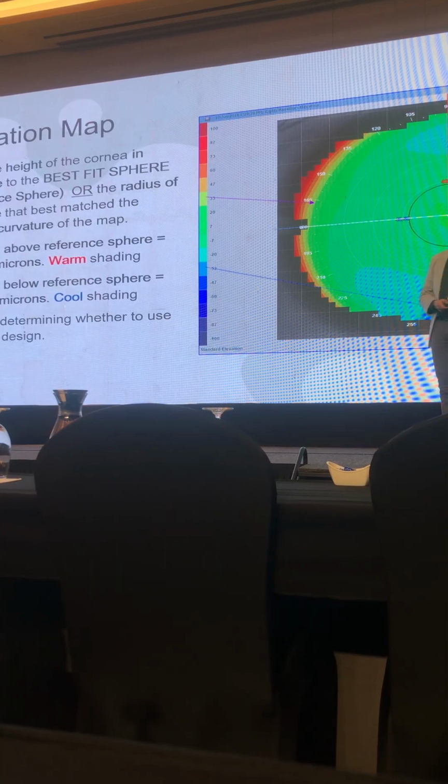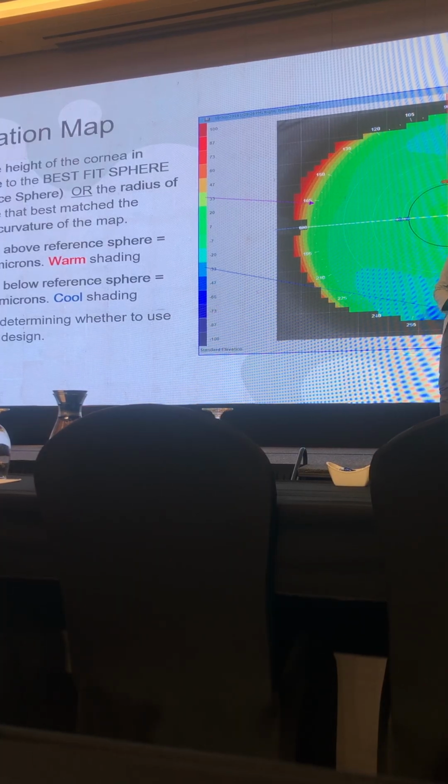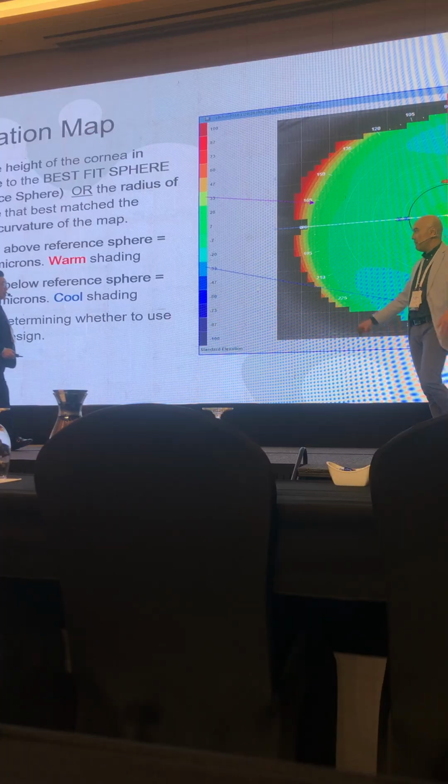Elevation map, this is so important. Very important. What is elevation?